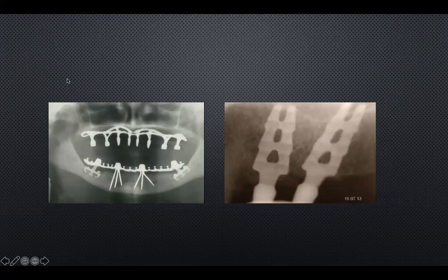I've seen one patient in Loma Linda University who has such a type of implant supported prosthesis, and it's been there for, I would say, 40 years, but this is the exception. It's not the norm. The norm is that these implants fail shortly after placement, again, because of either biologic or mechanical issues.